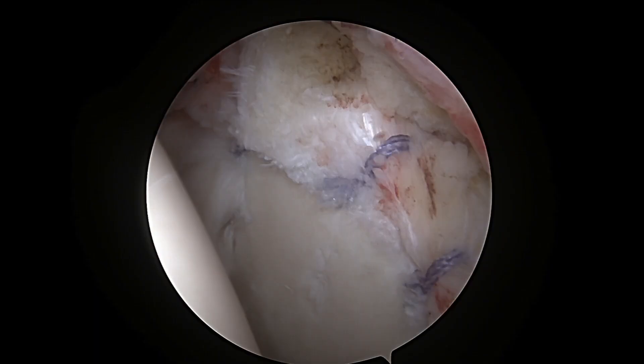In addition, because the labrum was so severely torn, we felt it was also necessary to repair it so there wouldn't be torn fragments remaining in the joint. Here you can see some of these blue-colored sutures that have now repaired that superior labrum.